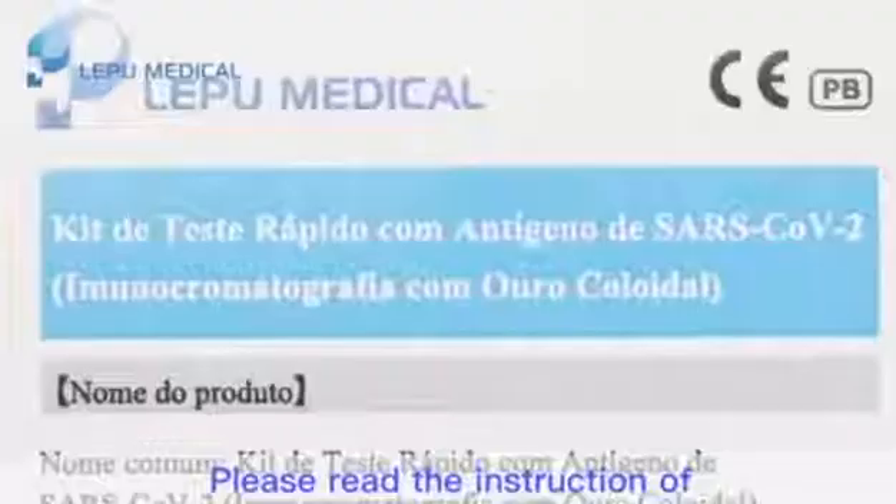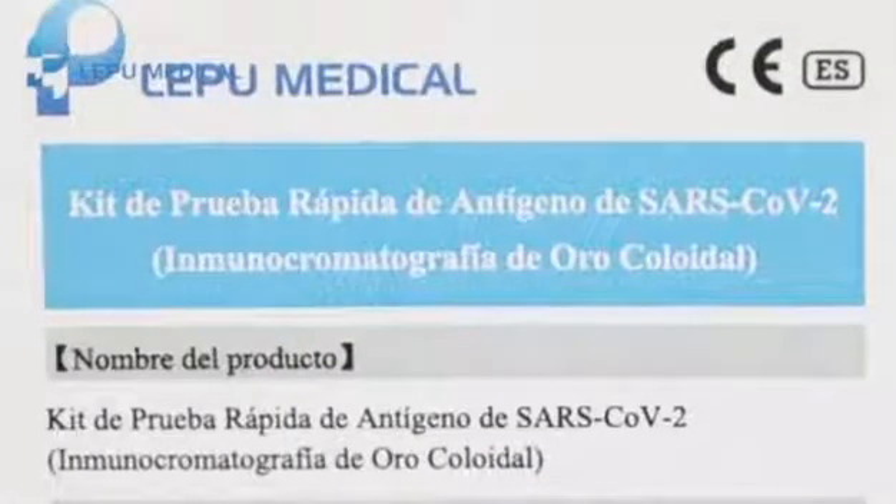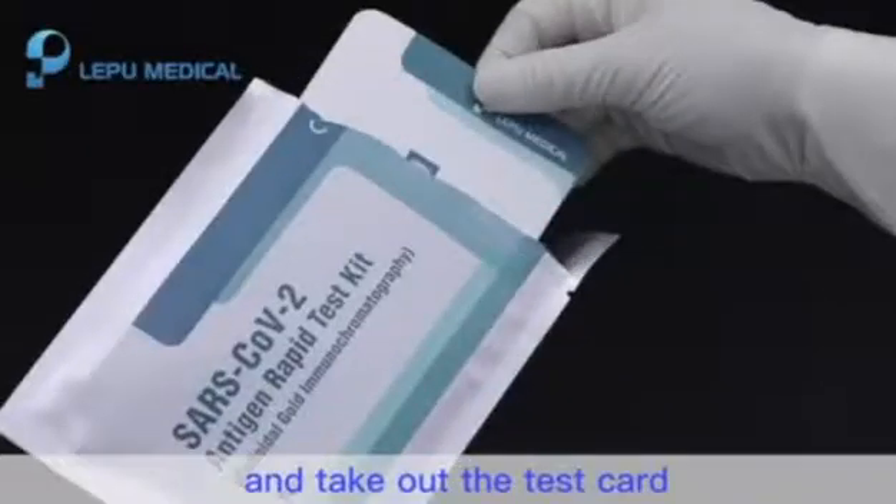Please read the instruction of use carefully before testing. Step 1: Tear off the sealed inner package and take out the test card.